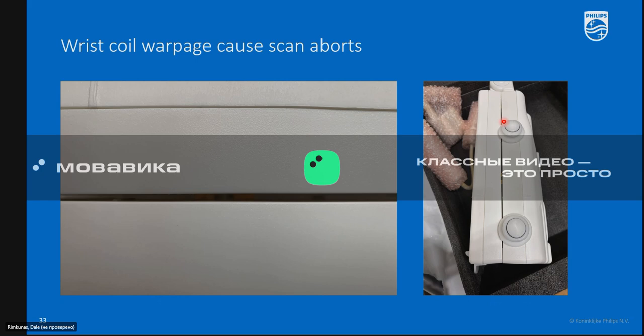Some coils are affected by this more. Some of the warpage on there is better or worse than others. Go ahead and replace this if they're having consistent problems with this. It has been redesigned. The new ones are shipping that are correct. You will get a correct one if you order a new one. The older ones are being taken out of stock. Just be aware of that. Nothing you can do to fix in the field.